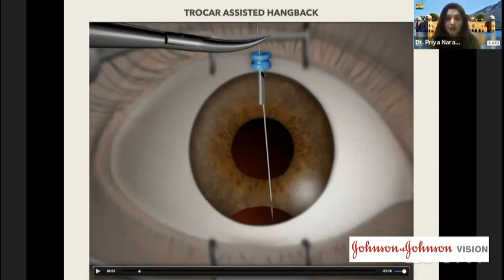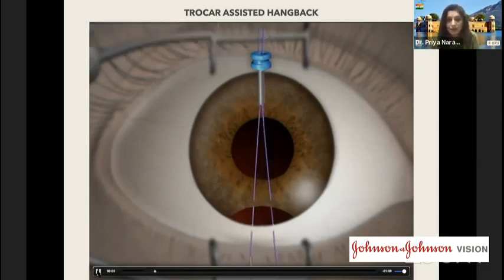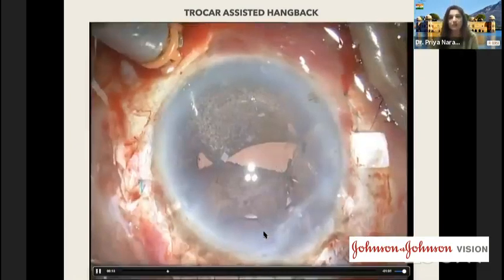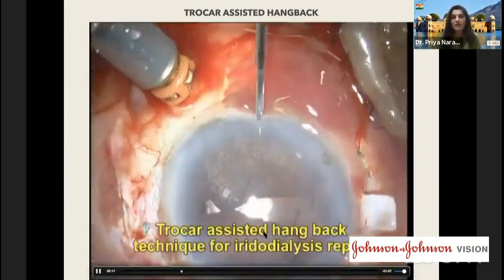is through the corneal incision, and you can just twist this around a little bit here and there. Then you can seal this incision with the stromal hydration that we usually do in our phacoemulsification procedures. So that's not a very big issue out here. I think this is one tip which people can use if they're facing this difficulty. And you can see how beautifully the suture slides into its place. This is a clinical demonstration of the same thing. You take up a trocar. This is a retinal trocar.